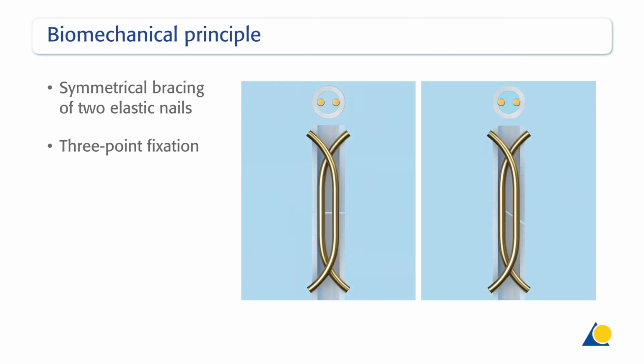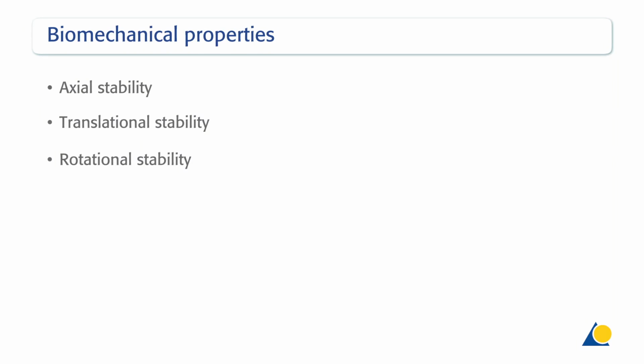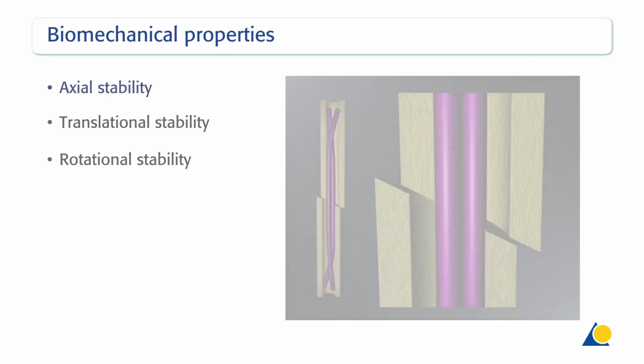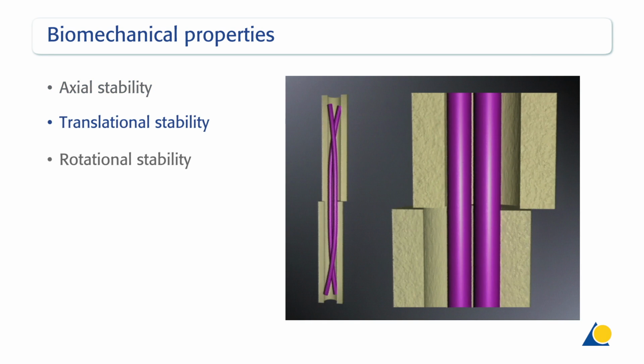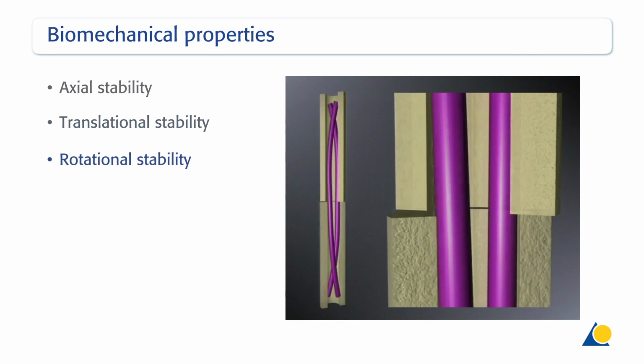The biomechanical principle of ESIN is based on the symmetrical bracing of two elastic nails inserted into the metaphysis. Each nail must be supported at 3 points in the bone. The three biomechanical properties of ESIN are axial stability, translational stability, and rotational stability.